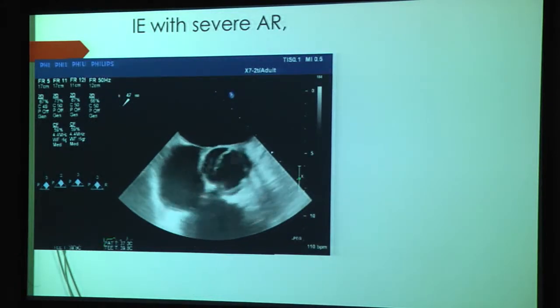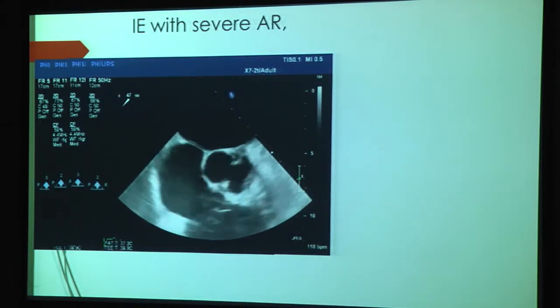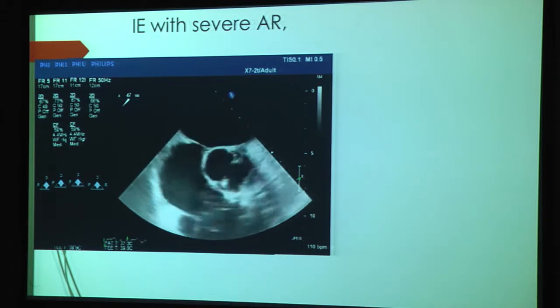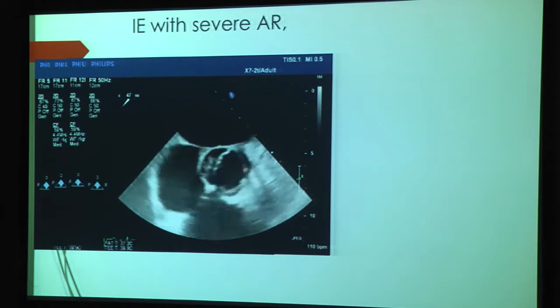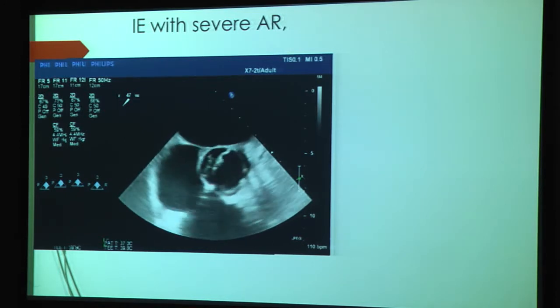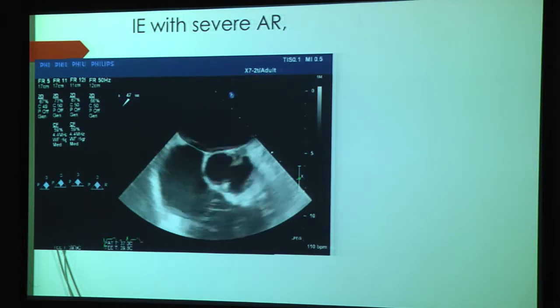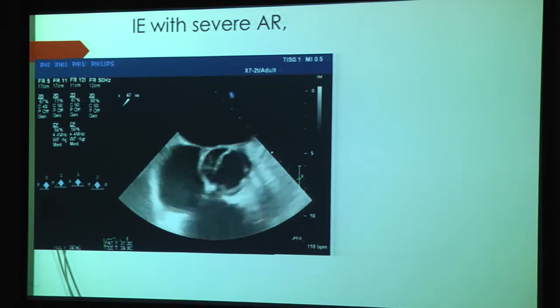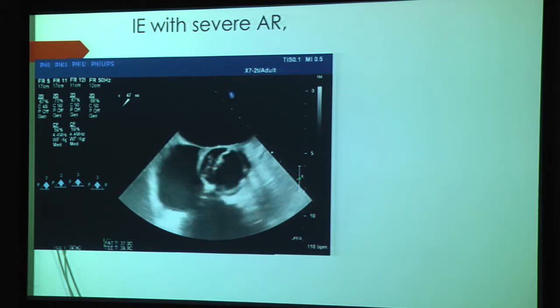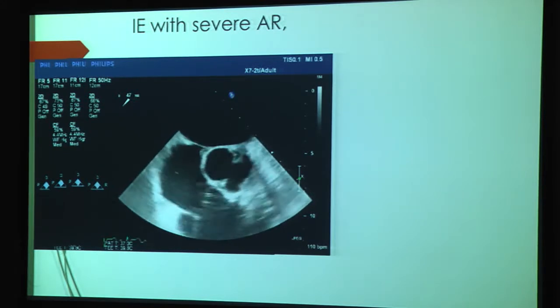And we're moving on to a short axis view of the aorta. And you can see this leaflet is not normal. It's a bicuspid leaflet, and the left and right coronary cusps are fused. So we have a vegetation on the non-coronary cusp side of the valve that's flipping in and out. And we have an elliptic opening of the valve in systole.